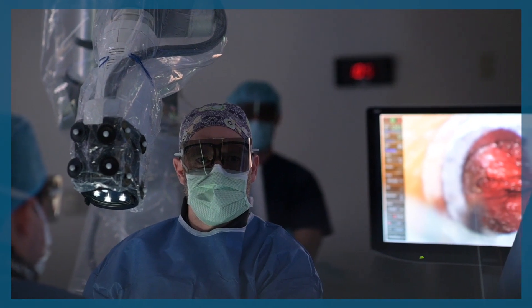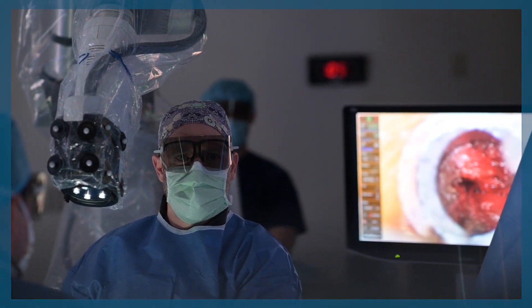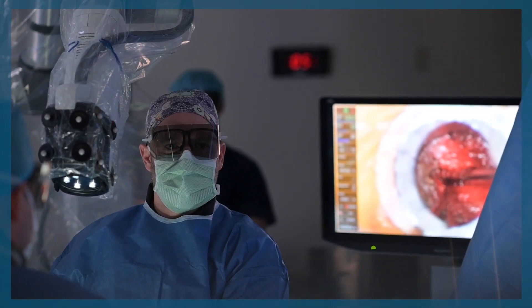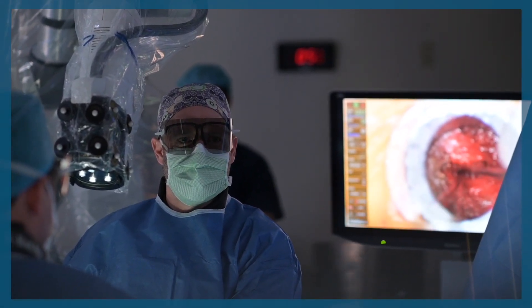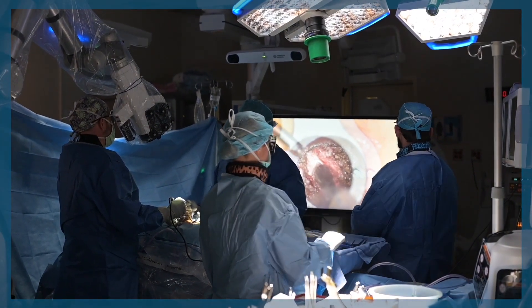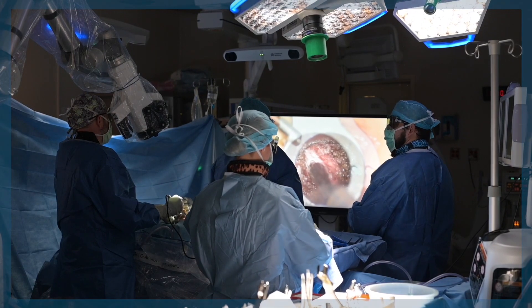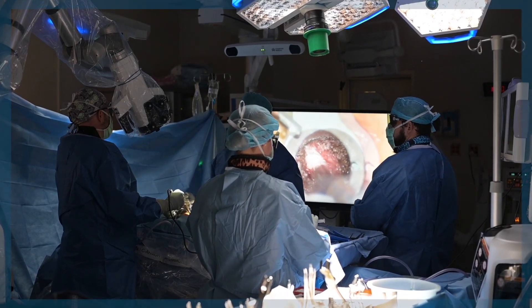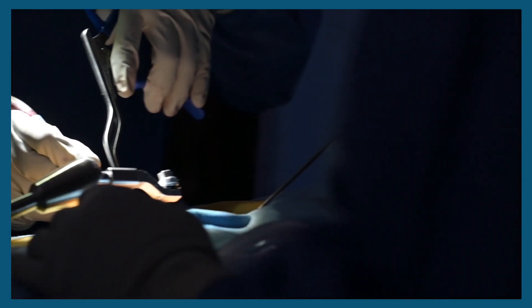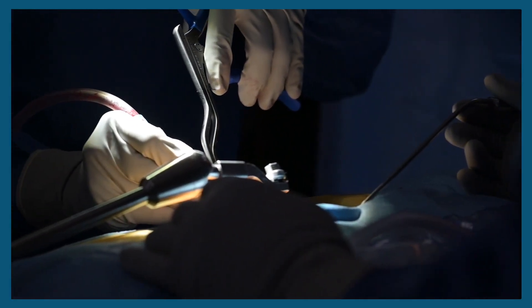If you're used to using the microscope, there's a little bit of a transition period to get used to using the 3D exoscope. You're wearing 3D glasses, and your posture just needs to be relaxed from the beginning. When you start using the exoscope, you just need to realize that you can relax and use your muscles in a more ergonomic fashion. With the exoscope technology, you're able to more easily and comfortably take out a disc herniation in someone's back, especially through a minimally invasive surgery, which traditionally has been limited by the viewing ability through the operative microscope.